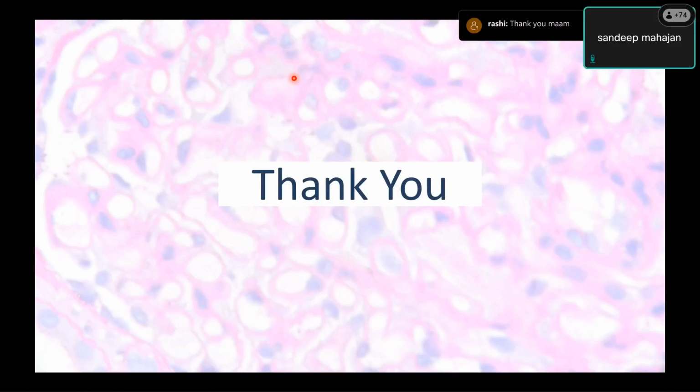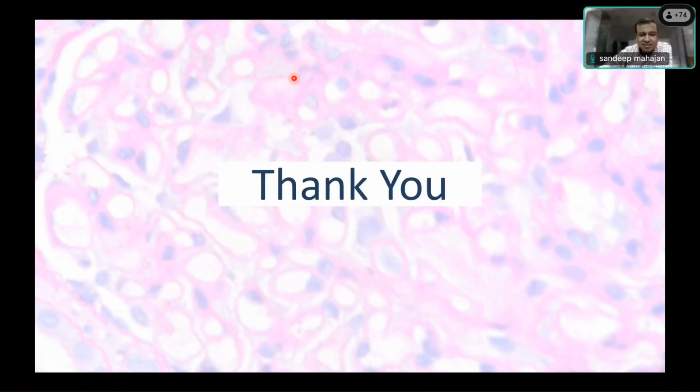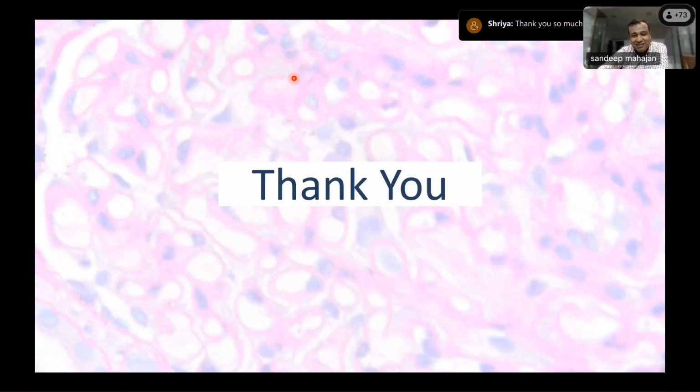So thank you, Dr. Vinita. It has been a very interesting session. I believe the students would have benefited a lot as to how to go about reporting a kidney biopsy. As you would have realized, it's a complicated process. You have to see the 4 compartments, report all the 4 compartments, do multiple staining, and on top of all, you have to do the clinical correlation.